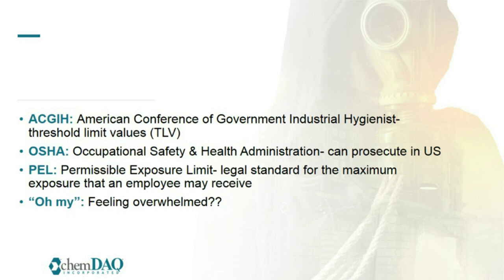Many of the compounds that were introduced in the 1970s were introduced as sterilants and high-level disinfectants, and they have no OSHA PELs or NIOSH RELs, but this does not mean that they're safe. For example, peracetic acid has a TLV of 0.4 parts per million calculated as a 15-minute TWA. OPA has no exposure limit, but undoubtedly is toxic.